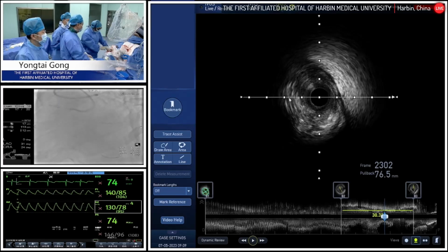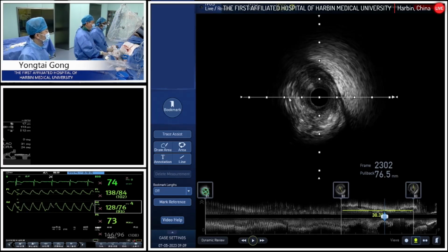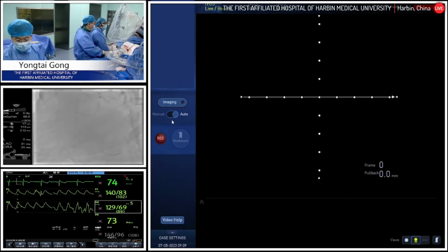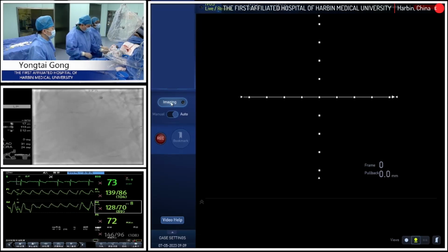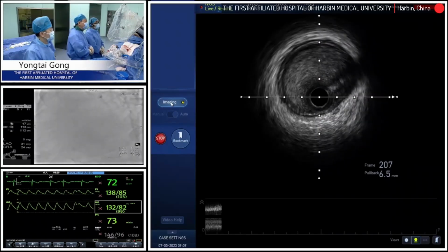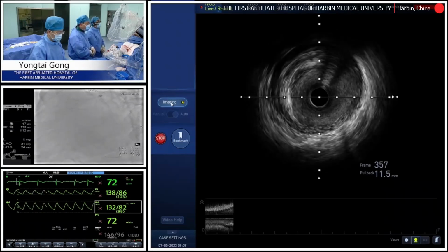Sure. I think this is a very good choice, using the cutting balloon for this plaque modification, because compared to other scoring balloons, the cutting balloon is highly likely to cause less trauma to the vessel wall. We know the microblade working height is relatively low, so it's less likely, compared to the NSE or other balloons, to cause very severe intima dissections. And here, as we start the pullback, once again we confirm it's over a 3.5 vessel. It's nearly 3.8 maybe by visual estimation.